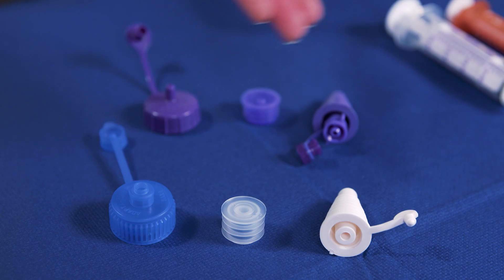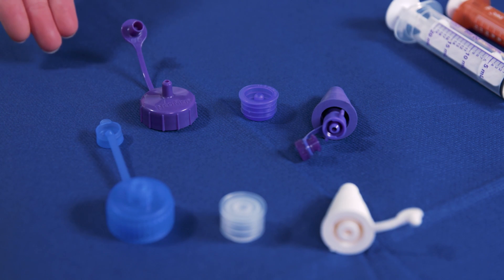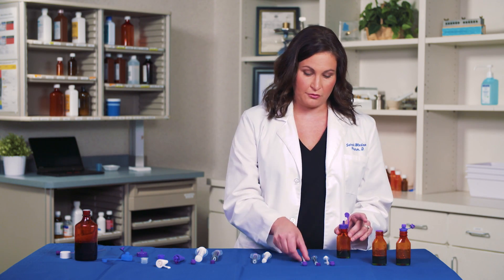Here are some examples of medication caps used with traditional oral syringes that you may be familiar with. Here are also the corresponding fill caps with the NFIT connector that will be available. First, make sure your medication bottle has an NFIT compatible cap such as the one shown here. Then, with the NFIT fill cap attached, connect the NFIT syringe.